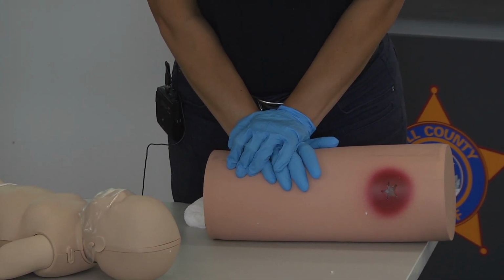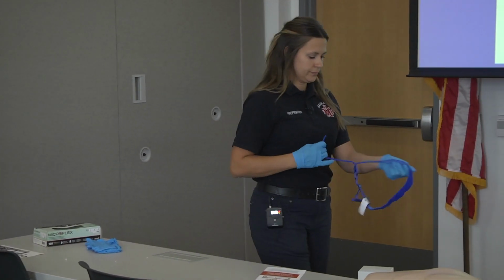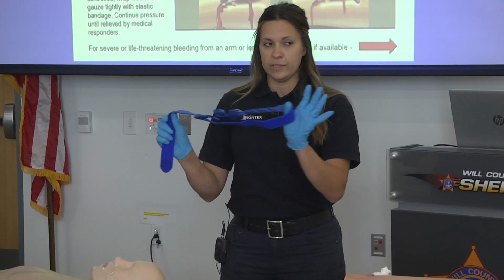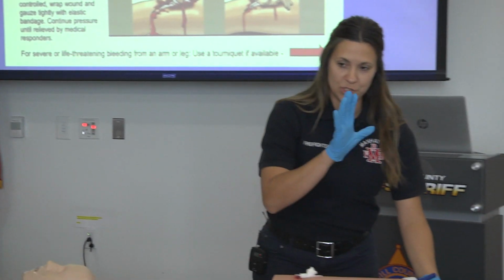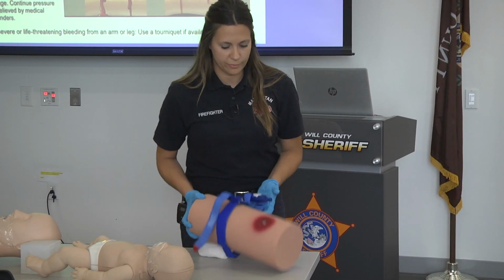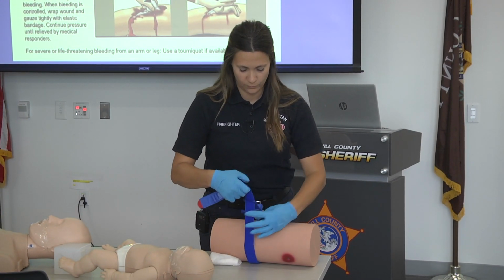If you do have a tourniquet at that point in time, now tourniquets are used as more so of a last-minute resort. To use a tourniquet, it's fairly simple. You would take it out of its package, unvelcro it, and I'm just using this for an example. You would apply it 2 to 3 inches above the injured area. We don't put these on joints. That's really important to know.